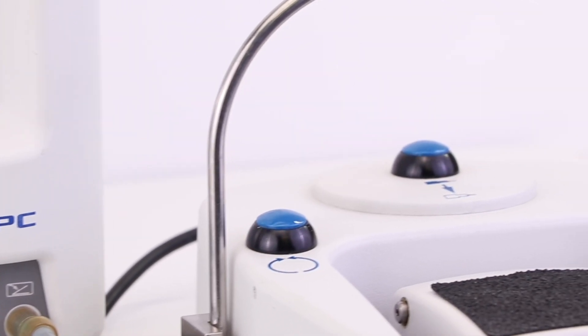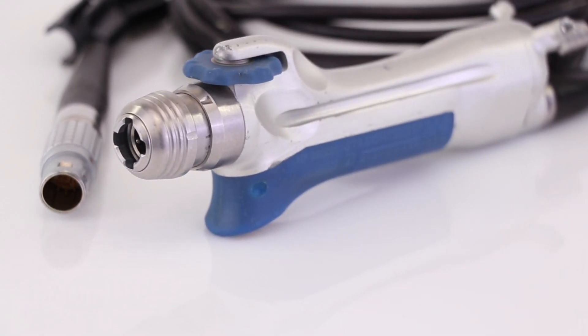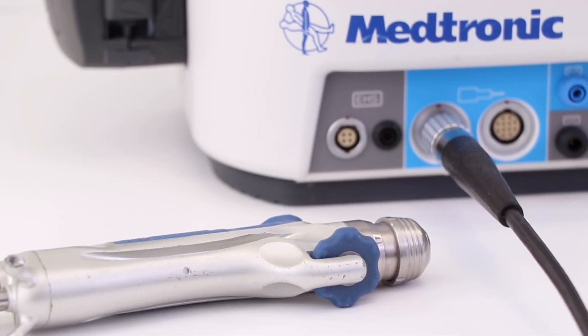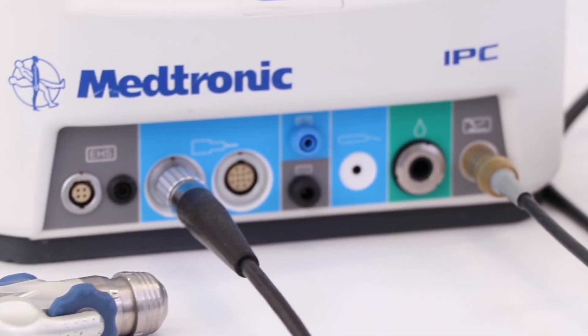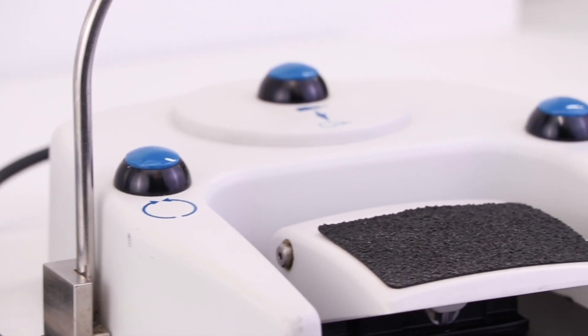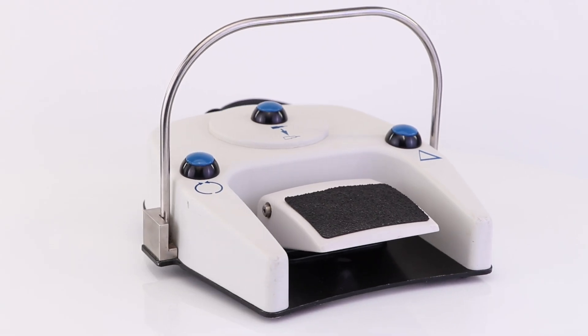The Integrated Power Console is inspired by surgeons and nurses, fueled to deliver innovation that transforms your OR. The ENT Surgery Console offers the most expansive range of application-specific products to serve your full range of ENT surgery needs, from inferior turbinoplasties to complex skull base cases.